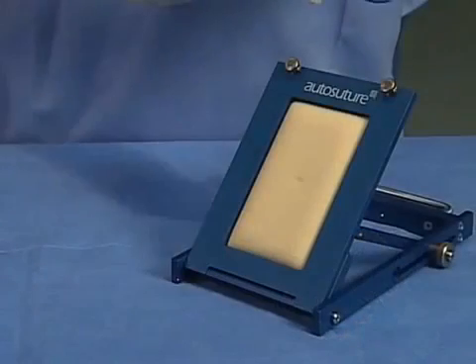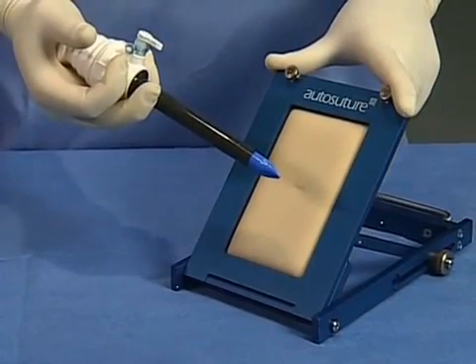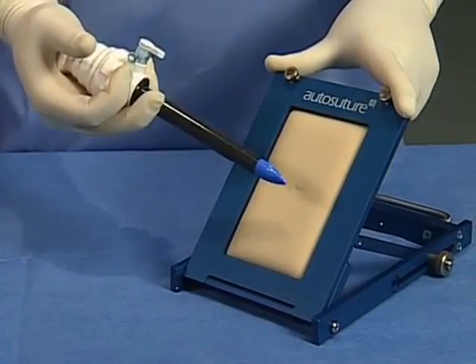To minimize defect size and reduce insertion force, do not rotate the obturator during insertion.